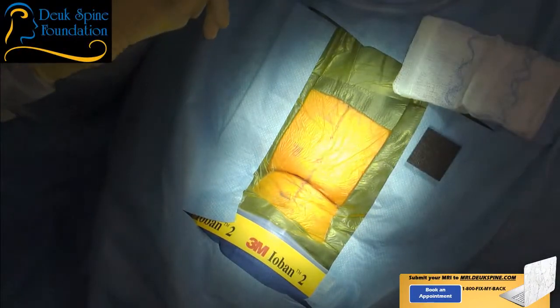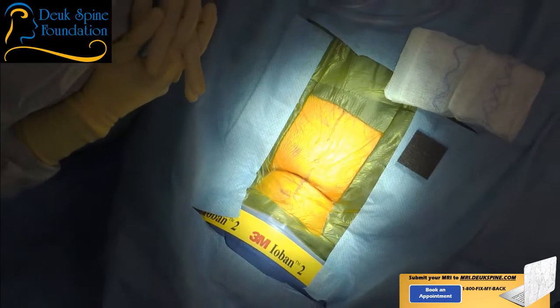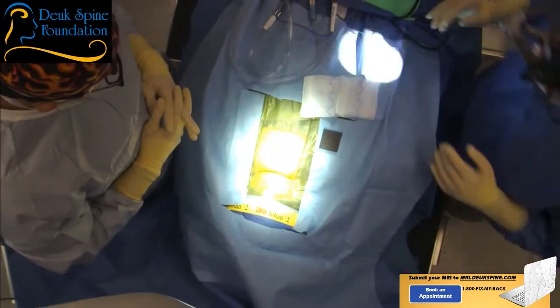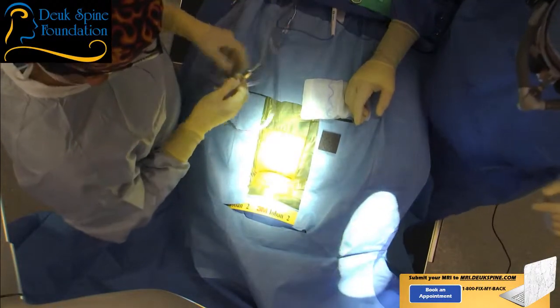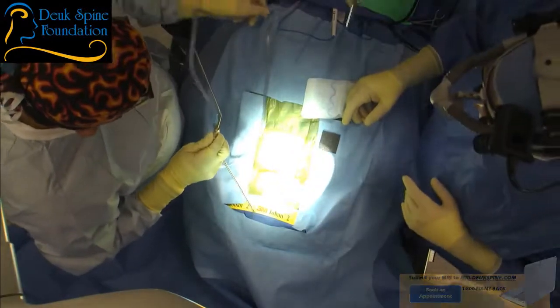We're doing a surgery called a posterior cervical decompression and fusion. That's the abbreviated version of it. Basically, this patient has pressure on their spinal cord and nerve roots at multiple levels in their cervical spine, which is the neck. And they're developing something called myelopathy, which is dysfunction of the spinal cord.